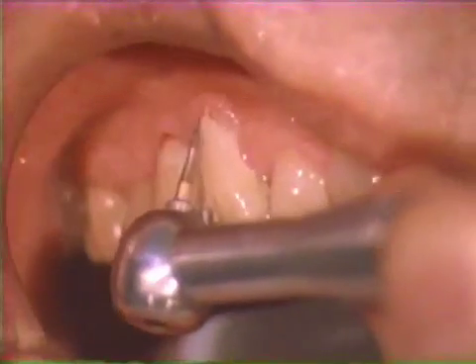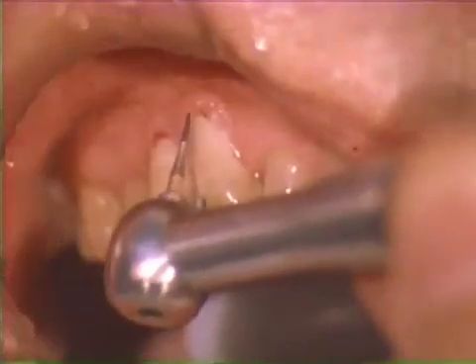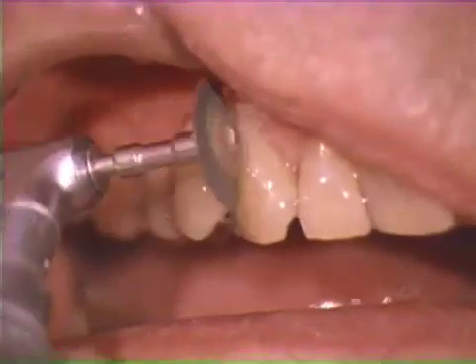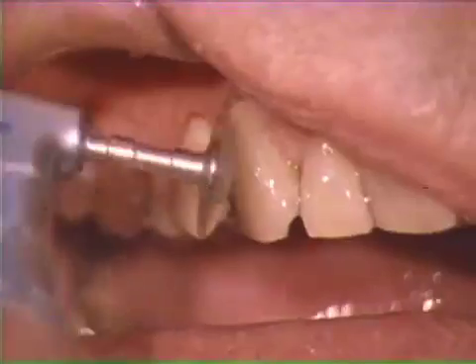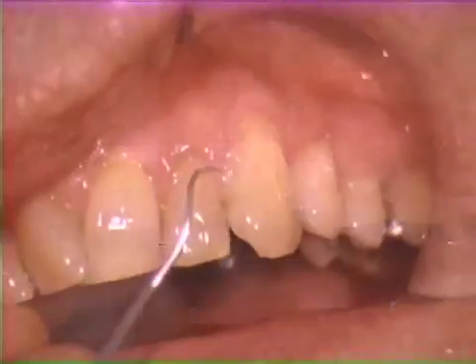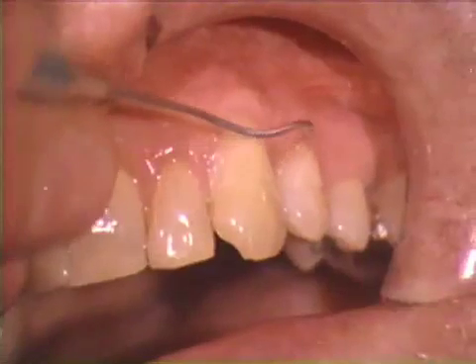A succession of burrs, discs, and strips of decreasing abrasiveness are used to contour and polish the restorations. This must be done using liberal quantities of lubricant or water in order to avoid a finished restoration that has a chalky surface. Such a surface is soft and will deteriorate rapidly. Cervical lesions treated in this manner restore missing tooth structure with a minimum of discomfort to the patient.